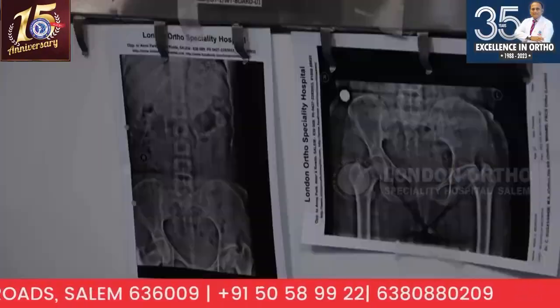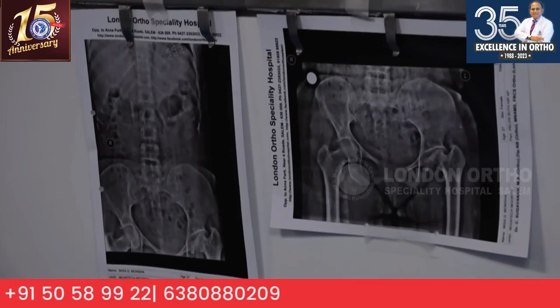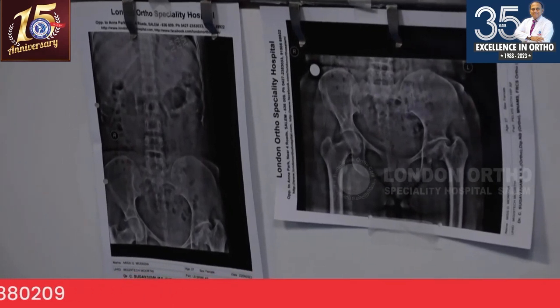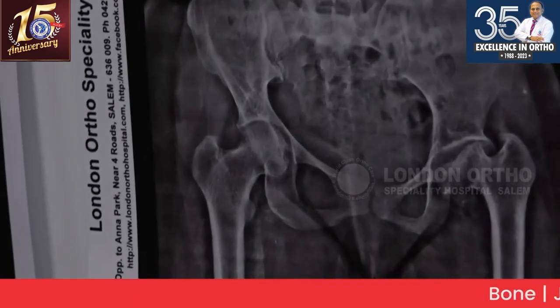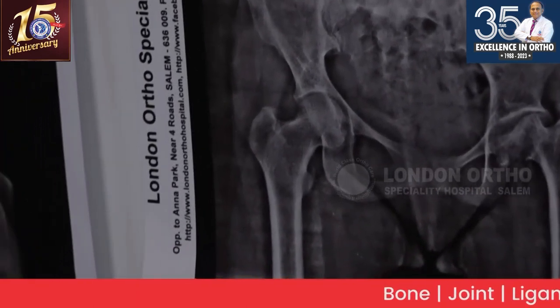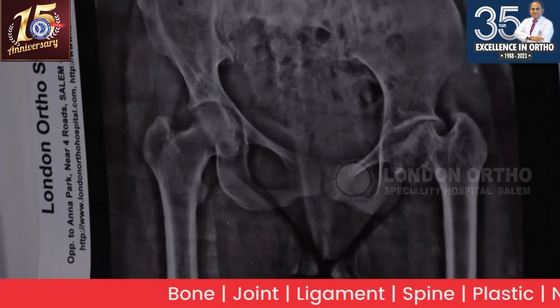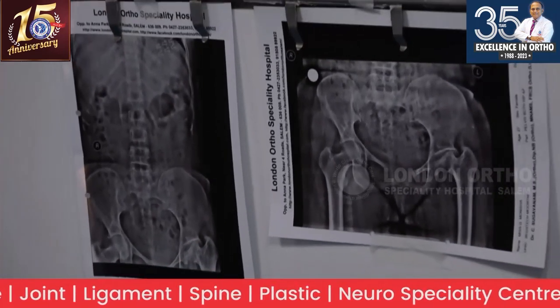The general rule of thumb is... you can see that on the other side, the head center lies slightly below the tip of the GT. That's correct. So in 80% of the patients, this can also be independent of coxa vara or valga. That's an independent parameter. But here you got a low head center, below the level.